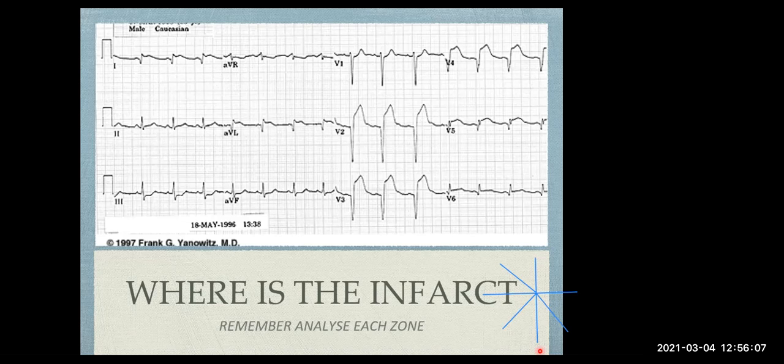So what does that tell us? It tells us that we've got either a problem on the left side of the heart. So in other words, the left side of the heart has been damaged, or that the right side of the heart has become enlarged. Okay. So let's just get to that.